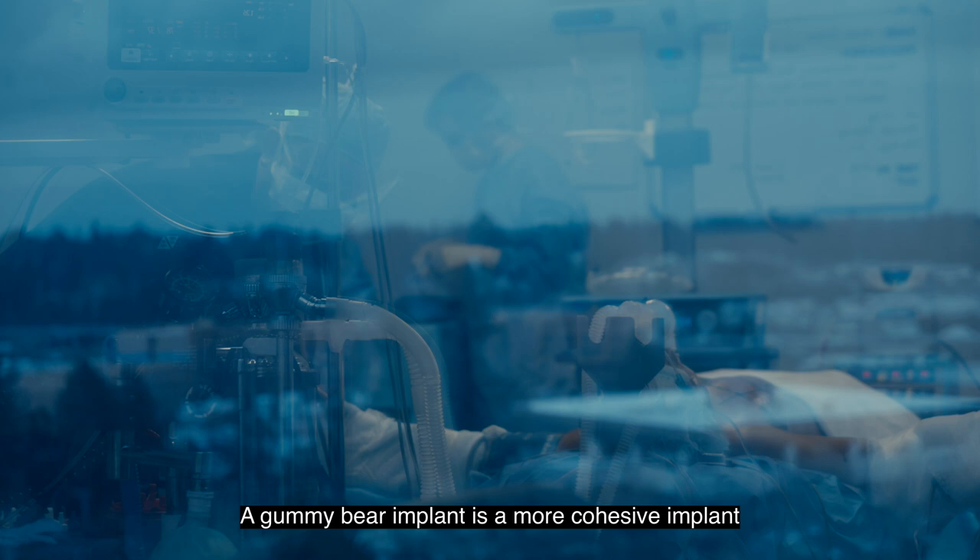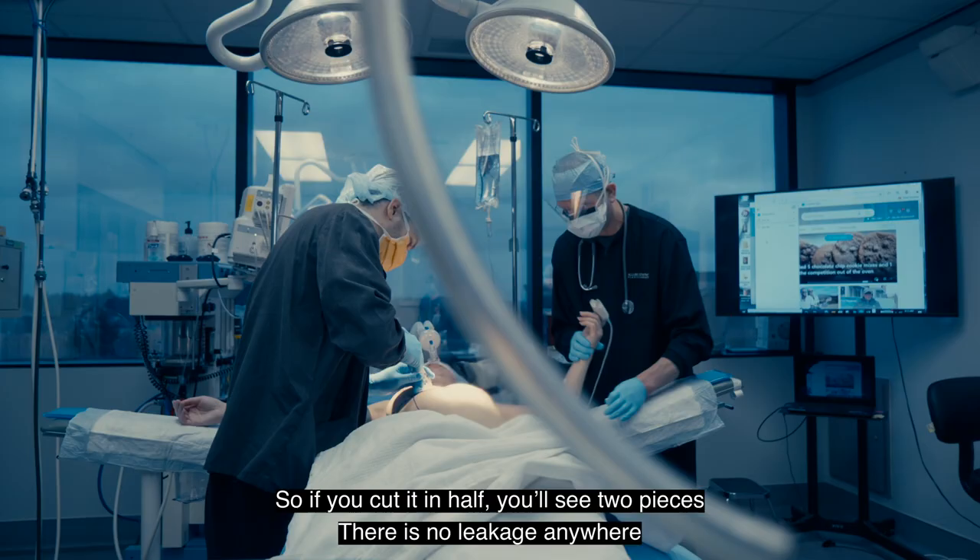Today we're going to be doing a gummy bear implant. A gummy bear implant is a more cohesive implant. So if you cut it in half you'll see two pieces — there's no leakage anywhere.